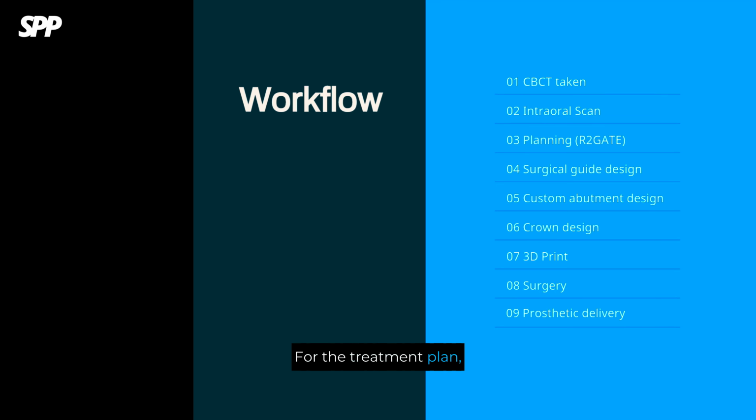For the treatment plan, when the patient first visited my office, I took a CBCT scan to obtain the DICOM data. I also performed an intraoral scan to get the STL file. After that, I scheduled the surgery date. Using R2 Gate, the planning software from MegaGen Implant, I completed the digital planning and designed the surgical guide.